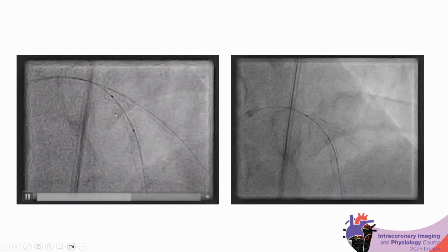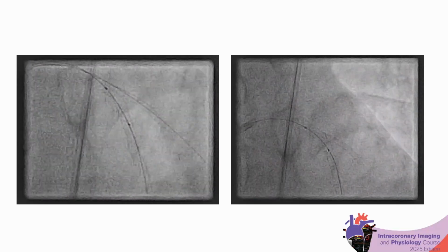You can see, I think, on the imaging that some of the diagonal stent is protruding into the LAD. I don't know if you can see that on your screen, but it's clear. So obviously, it was not a very ostial position of the stent. It wasn't ostial at all. I think in any case, in this kind of angle, you cannot achieve an ostial position. Either you miss the ostium or you go inside the main branch.